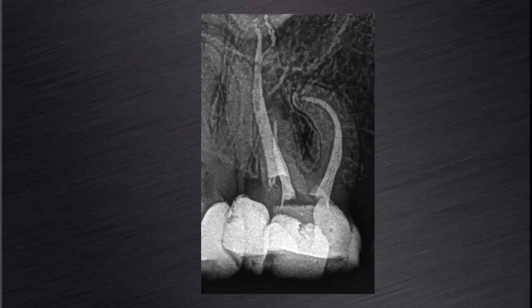This is the post-operative radiograph that illustrates the immediate post-operative result, clearly showing maintenance of the root canal anatomy in the mesobuccal root canal system using this protocol that I've just described.